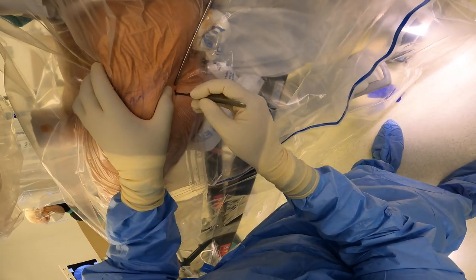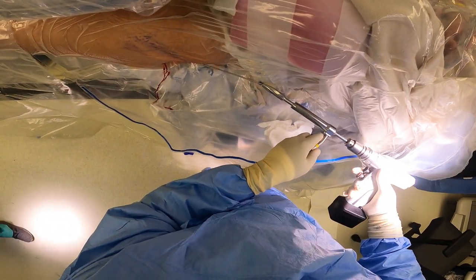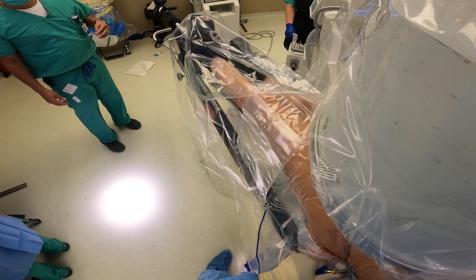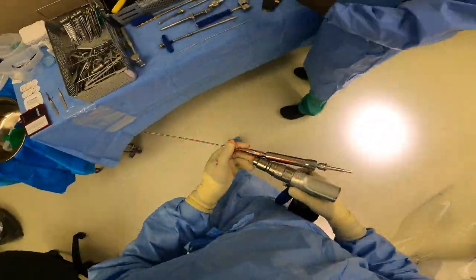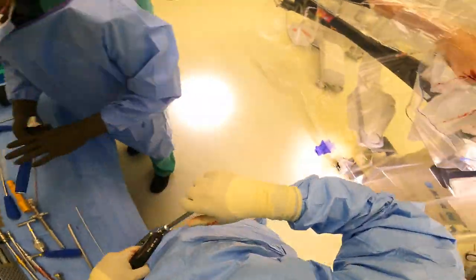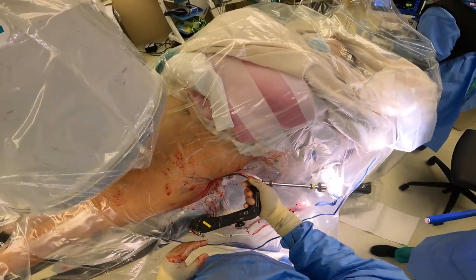We're going to make the incision here. This is a reamer, or a starting reamer, and this will essentially create a hole in the bone. Then the nail would go over this hole on the inside of the bone to stabilize the fracture. I'm using a short nail in this case; there are longer nails that span the entire length of the femur. If a patient has a more distal femur fracture — like a mid-shaft or a subtrochanteric femur fracture — I'll use a long nail. We're checking to make sure it's in good alignment and that it's working so that when we put our pins in, everything will be aligned.